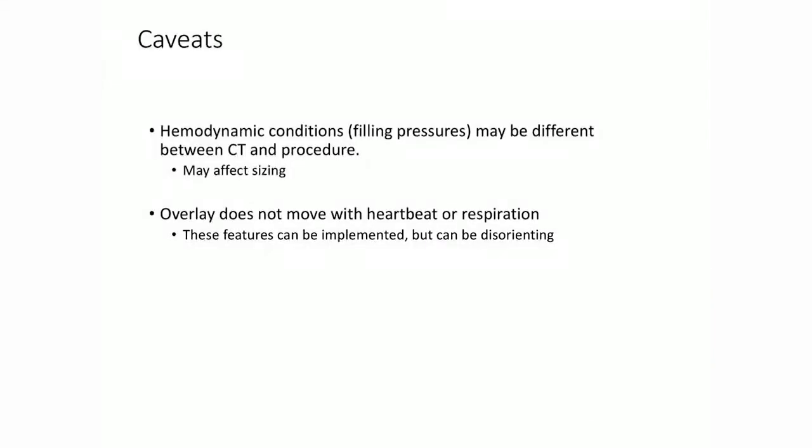Now the caveats of MSCT fusion imaging, because there are some. First is the hemodynamic conditions of the patient and the filling pressures that may be different between the day where the CT was performed and the day of the procedure, and this may affect the sizing of the device. So it's always important to confirm every measurement by TEE. So this is why we still perform our procedures with TEE, both for sizing confirmation and for device positioning confirmation.